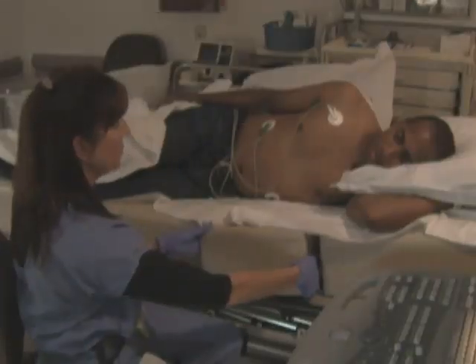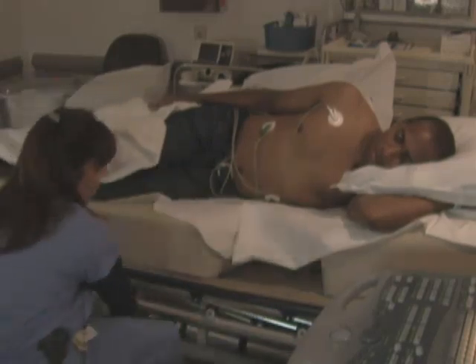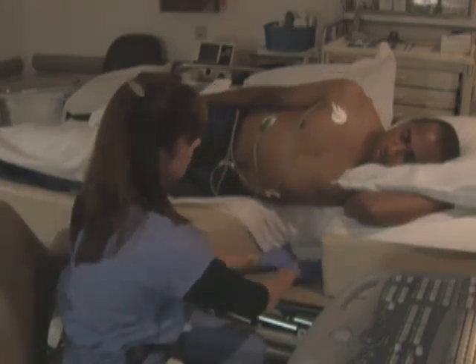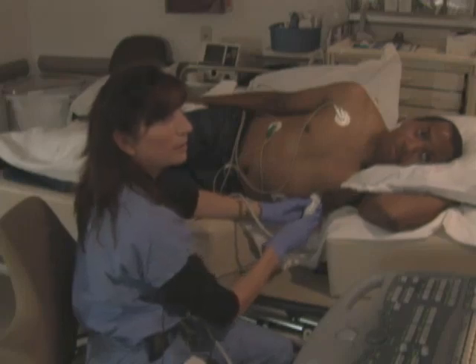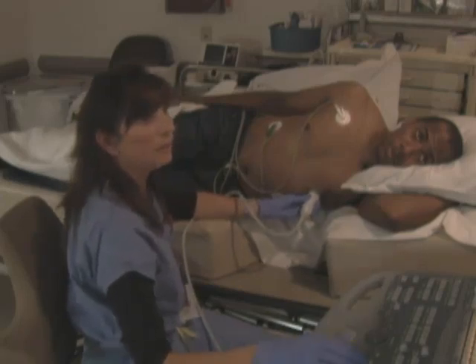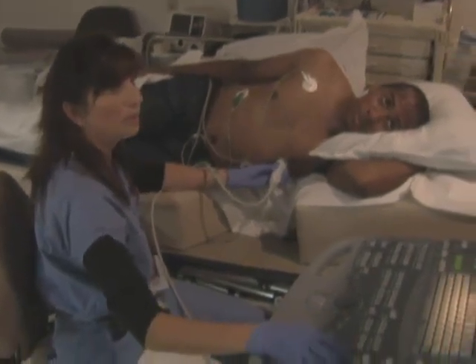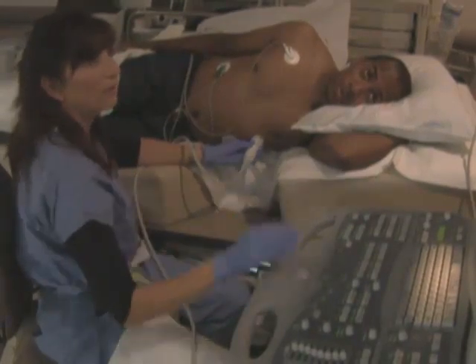After completing the parasternal views, the cardiac apex is located and the patient positioned with the apex over the cutout on the examination stretcher to allow placement of the transducer on the apex with free motion of the transducer as needed to obtain diagnostic images. Again, ultrasound gel is used to provide acoustic coupling between the transducer and the patient's skin.